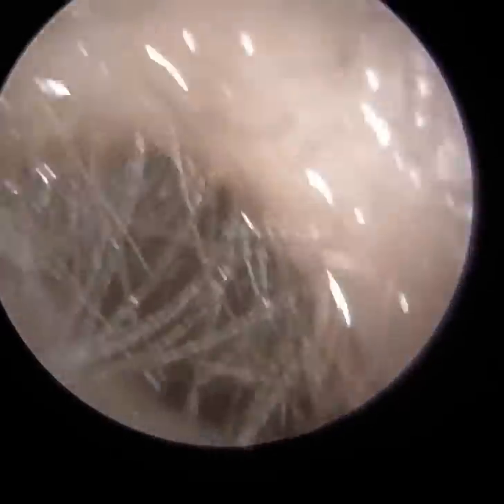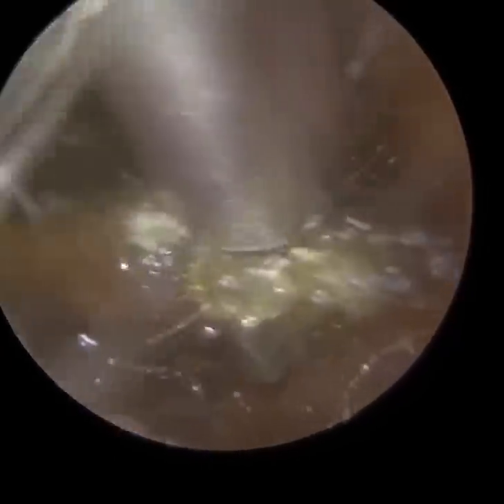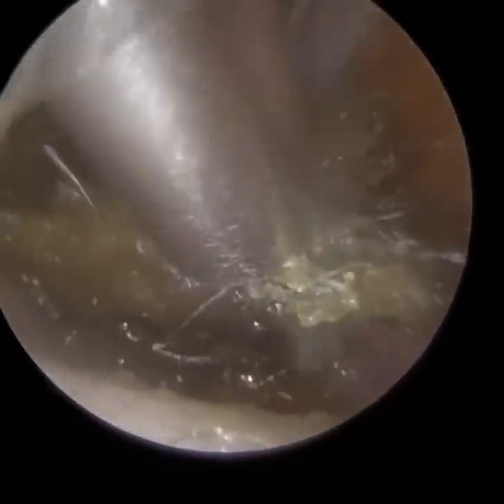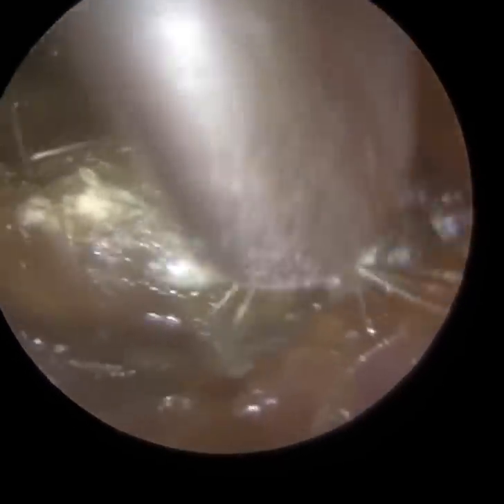Similarly in this procedure — this is the patient's left ear — once I've removed this occluding earwax, which was quite stubborn, the patient had been really suffering with their hearing. We're going to take a peek into the patient's middle ear, and it's quite amazing. It's probably one of the best optics I've managed to obtain with the iClearScope. We are literally going to be looking into the middle ear space, hence the name.